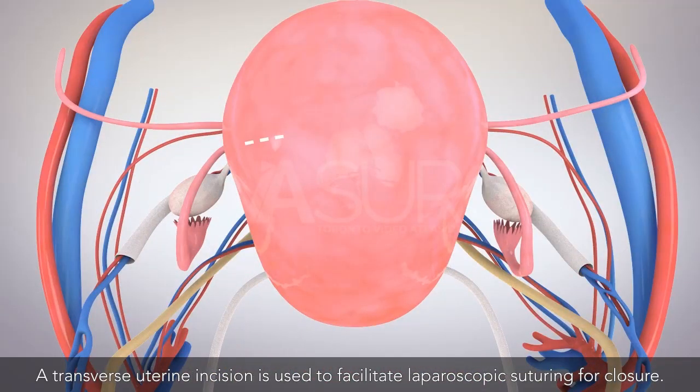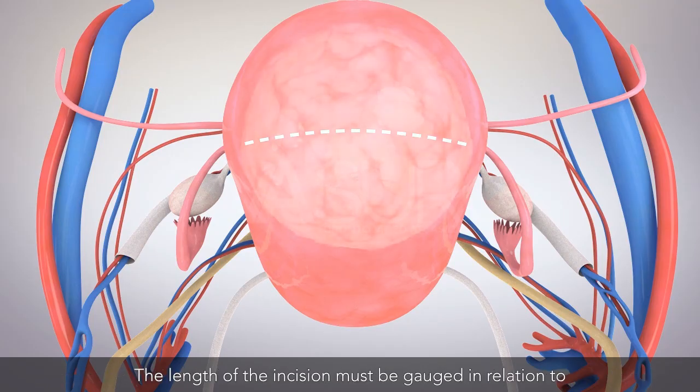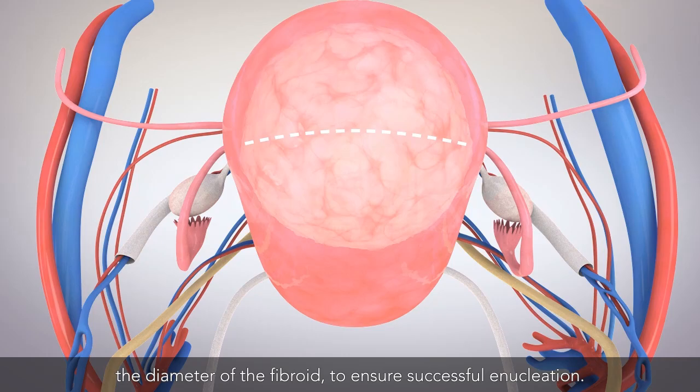A transverse uterine incision is used to facilitate laparoscopic suturing for closure. The length of the incision must be gauged in relation to the diameter of the fibroid to ensure successful enucleation.